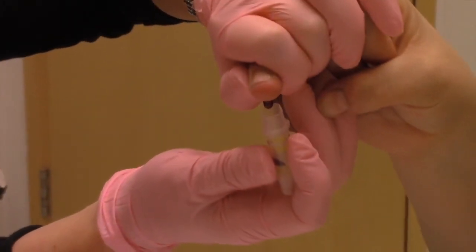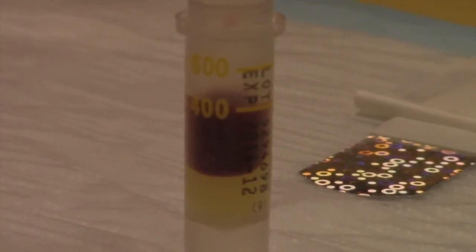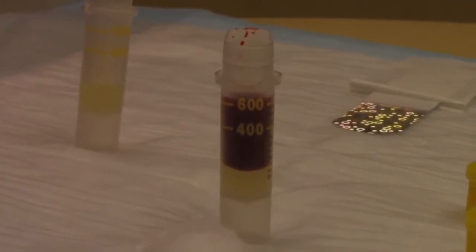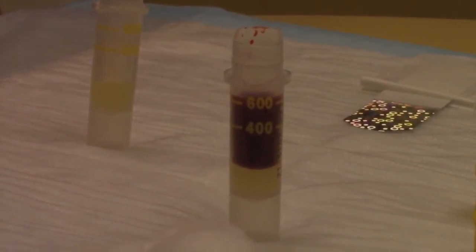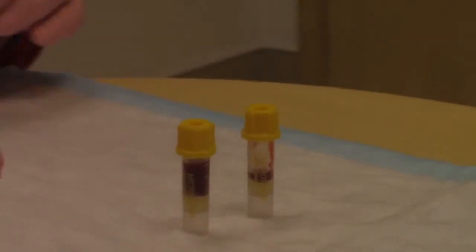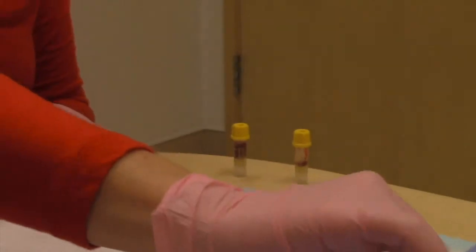We would like for the tube to be filled to the 400 microliter line at a minimum. However, filling the tube to the 600 microliter line is ideal. If there is enough blood to fill two tubes this can be done as well. Please return the tube even if you are unable to fill it to the 400 microliter line.